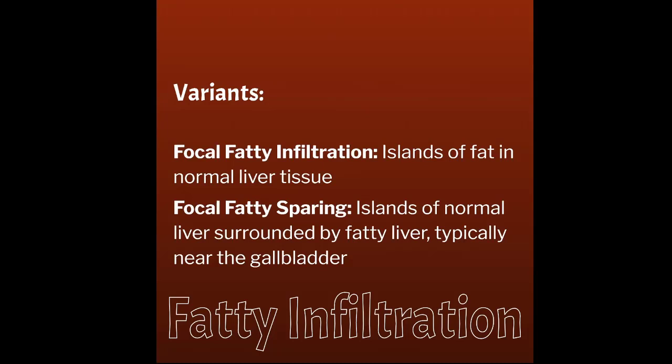For the most part, when I see it on ultrasound, I don't necessarily measure it, but I do take pictures of it, maybe with an arrow pointing at it, just to show the radiologist that I saw it, and then they can determine. I still take pictures of it with and without color in long and transverse images. I just don't necessarily measure it, especially if it looks like focal fatty sparing versus some sort of mass in the area.